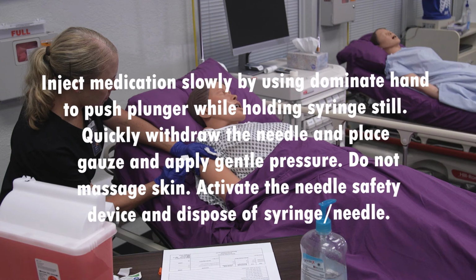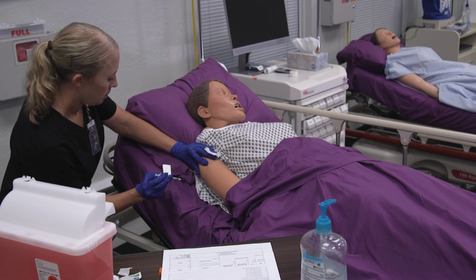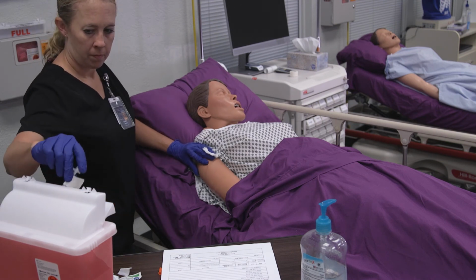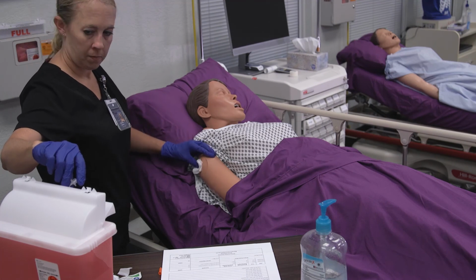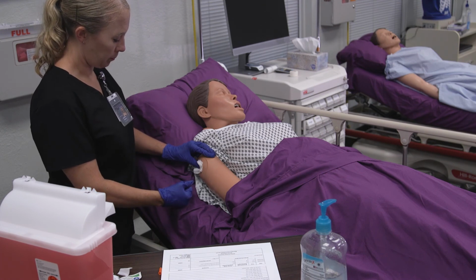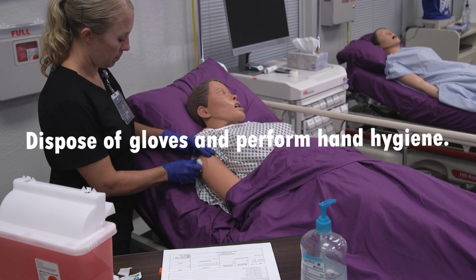Inject medications slowly by using dominant hand to push plunger while holding syringe still. Quickly withdraw the needle and place gauze and apply gentle pressure. Do not massage skin. Activate the needle safety device and dispose of syringe needle. Dispose of gloves and perform hand hygiene.